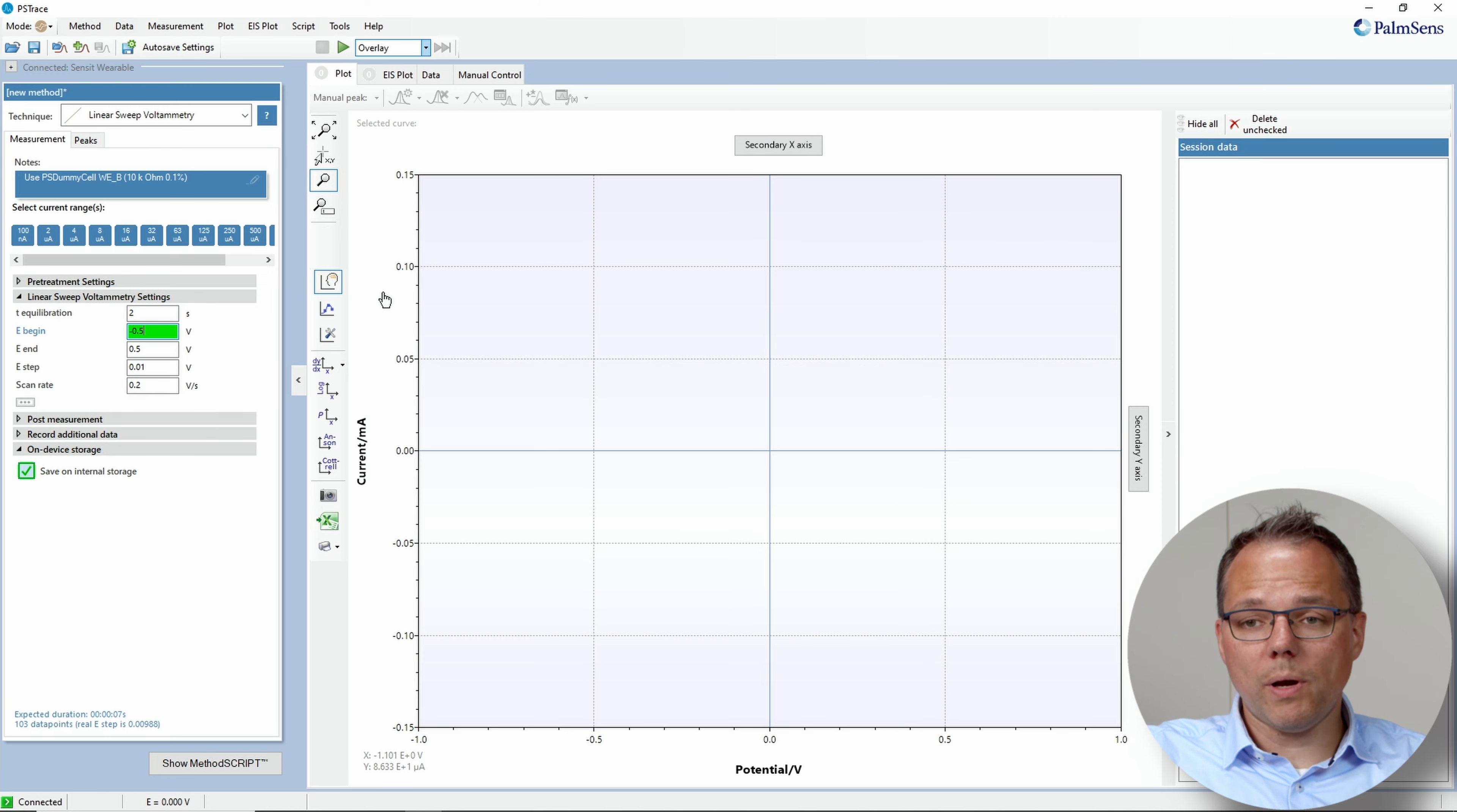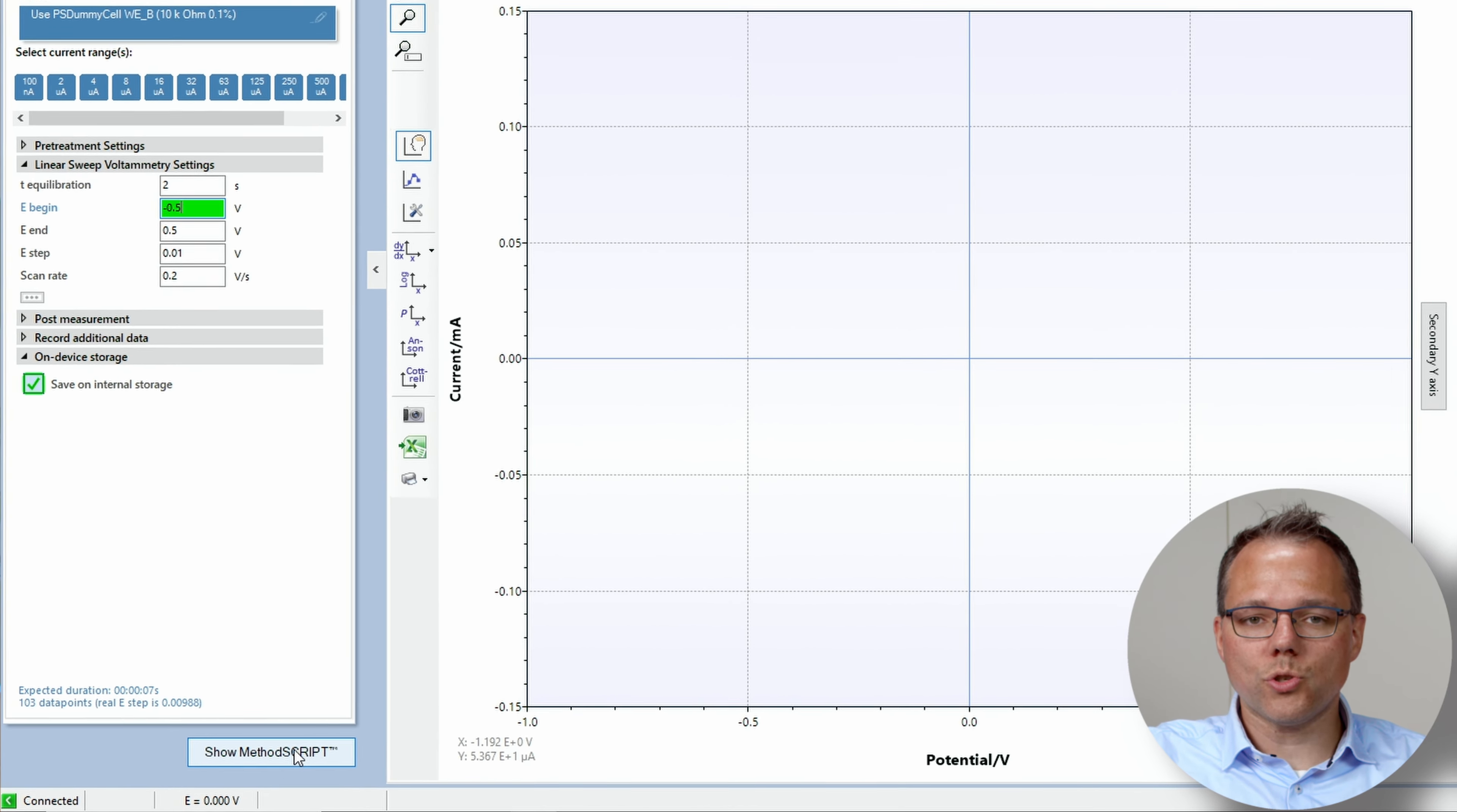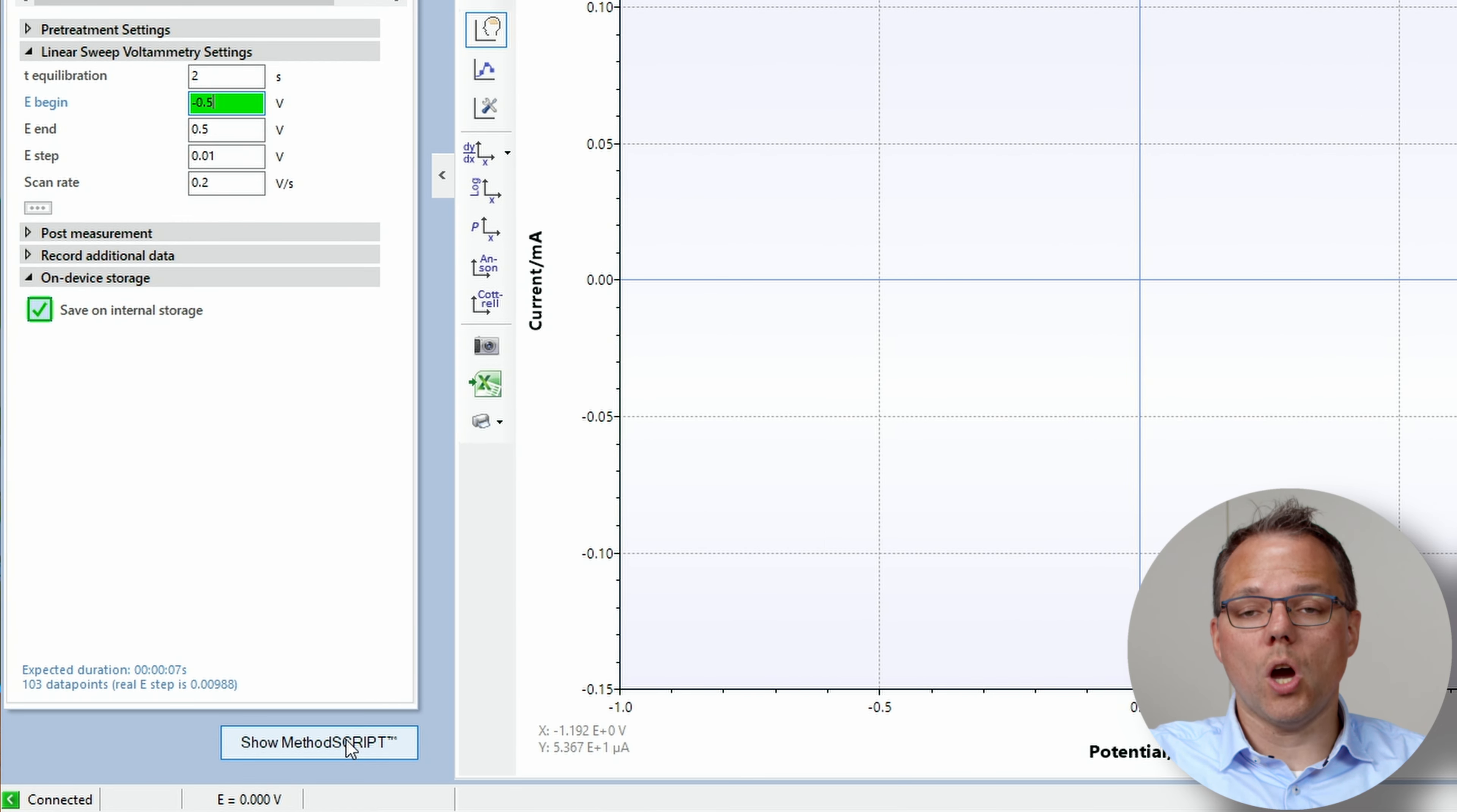There are multiple ways of doing this. Let's start with the first way where I want to show you how to automatically start a measurement when the Sensit wearable is switched on.